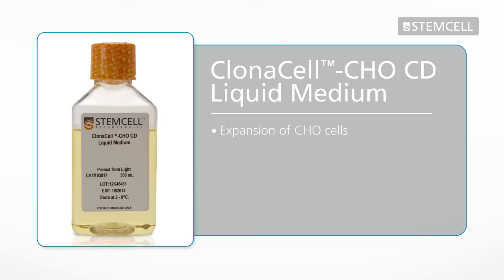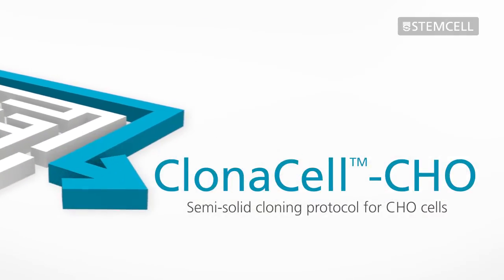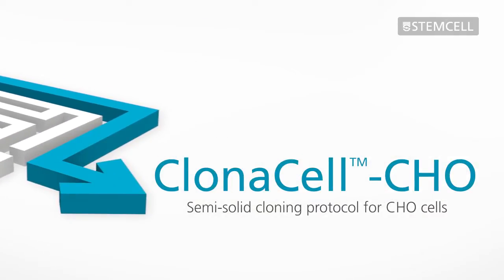This medium can be used for expansion of CHO cell lines. This video describes the semi-solid cloning protocol for CHO cells using Clonacell CHO media.